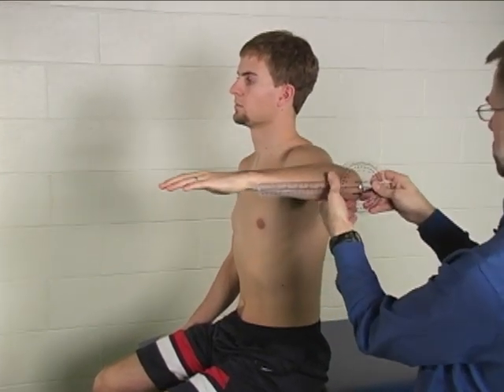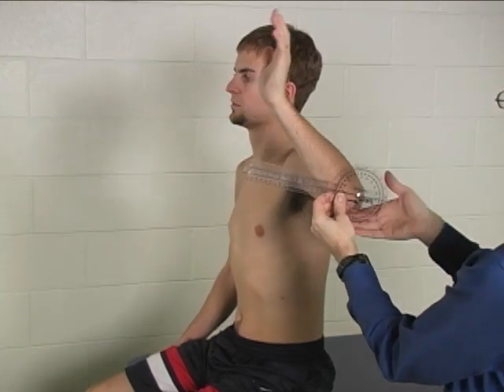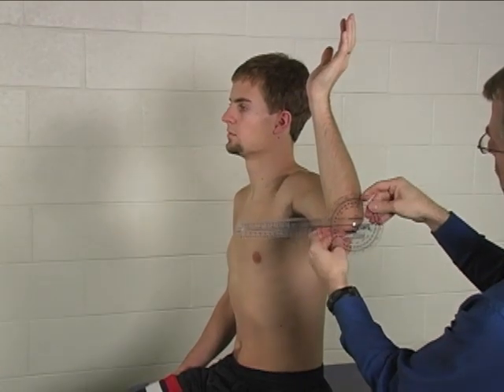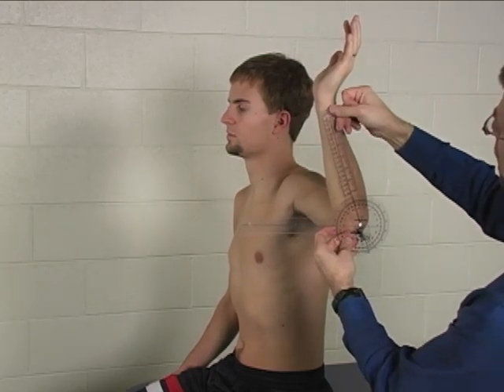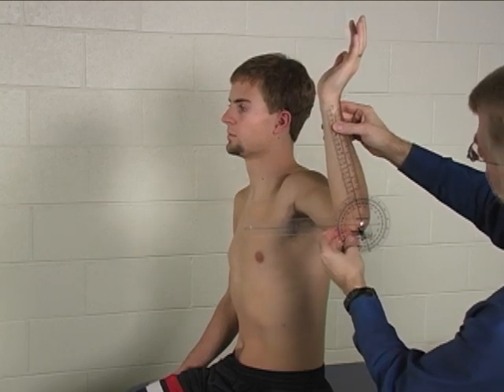This is the starting position, and then I'm going to have you bring your hand back as far as it will go. In the ending position, still line up the axis with the olecranon process, the stationary arm is still horizontal, and the moving arm is still lined up with the ulnar styloid.